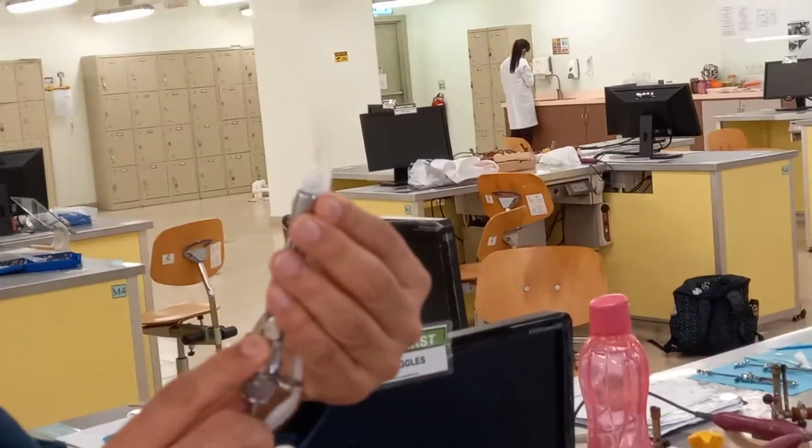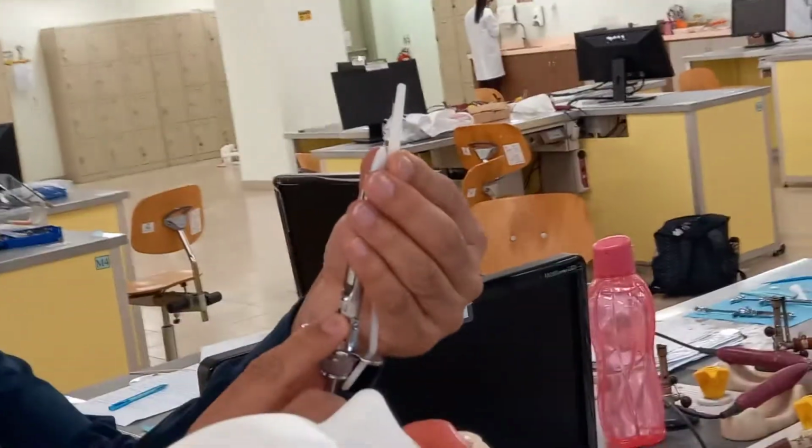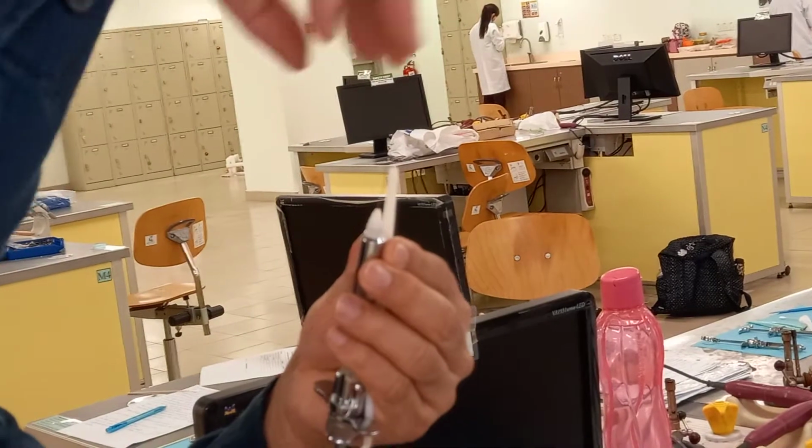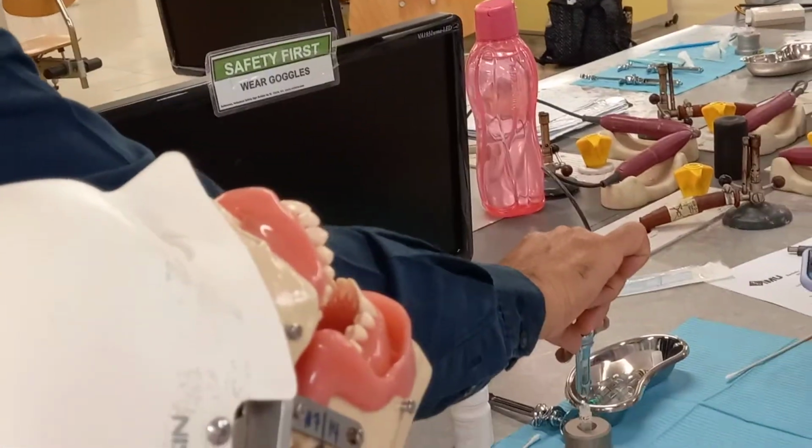Suppose, for example, this tooth root is not like this, and it's a bit like that, because some roots can be mesial or this. Then you just angulate your syringe and needle in the same direction. Suppose this is the tooth root, your needle tip should be above the apex of the tooth. Should not be below, then it won't be effective. It has to be above the apex. Then the anesthesia will be on top and it will completely anesthetize.